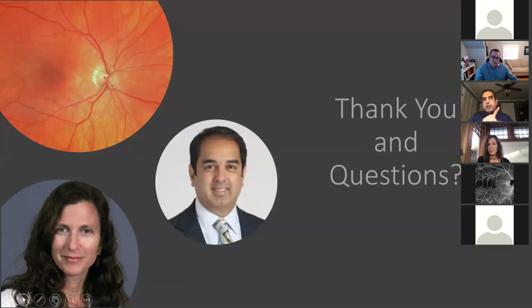Yeah, actually, we published a study with OCTA where we looked at that dark halo effect. That dark halo effect means a very high frequency of retreatment with anti-VEGF, less than 4 weeks or 6 weeks at most. Most of those patients without the dark halo could be extended 10, 12, 14 weeks and further. So there was a very big differential. That's a reason to get an OCTA for me a lot of times on the initial examination. And the nicety now with Retina Workplace is that I can put it up and follow it alongside my OCT across all those intervals. I showed you the macular thickness maps, but you can look at the OCTA as well.